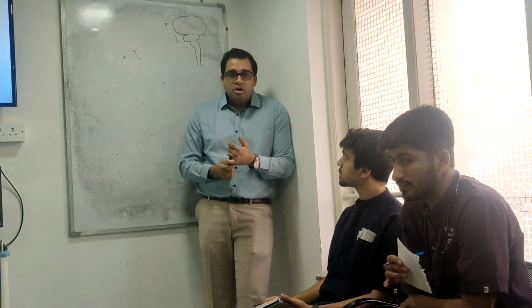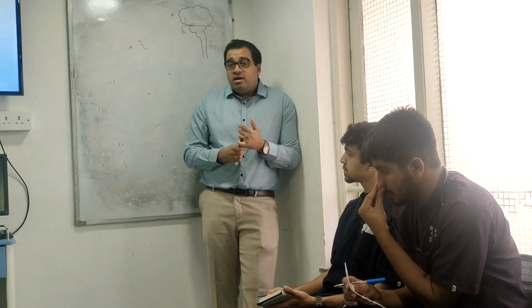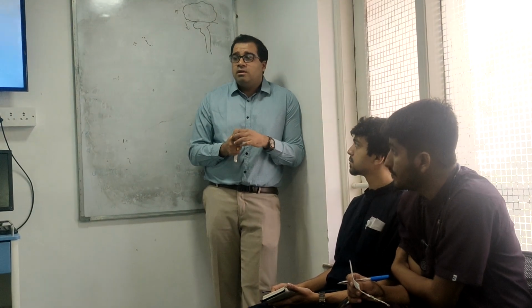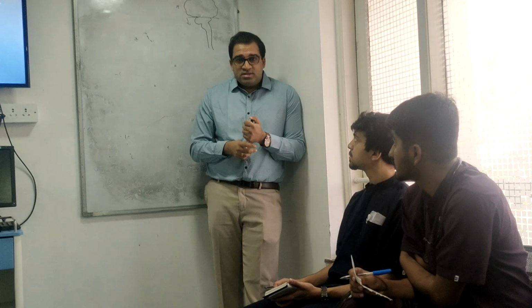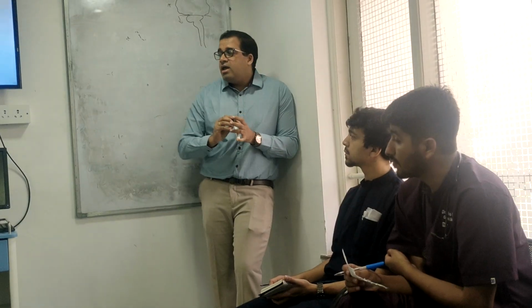We have BCID2 now. BCID1 has been discontinued almost 5 years ago. BCID2 gives you almost 43 targets, जिसमें 34-35 organisms हैं and there are 8-9 resistance mechanisms. Okay, we'll discuss BCID2 in detail sometime later once you discuss gram-negative resistances. नहीं तो there's no meaning to it. But you should know there's a panel available to get an earlier diagnosis in sepsis.